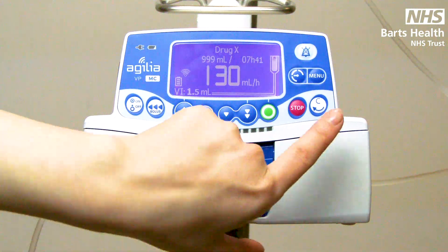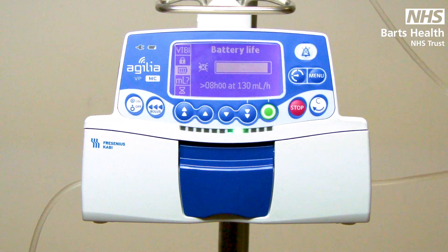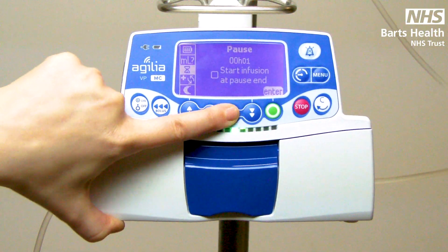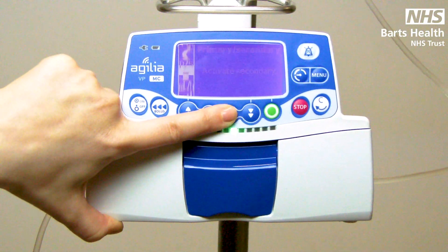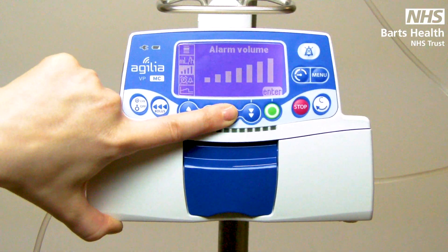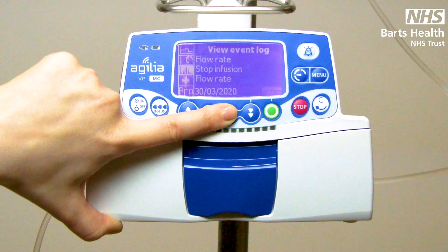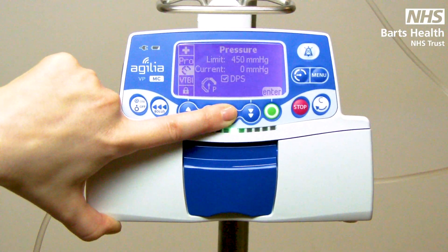As with the SP, you'll find most of your additional functions in the menu. This is where you'll find your battery life, volume infused, pause function, change drug, day and night mode, program bolus, some other programming features, alarm volume, callback alert, your graphs, event log, information, and your pressures page.